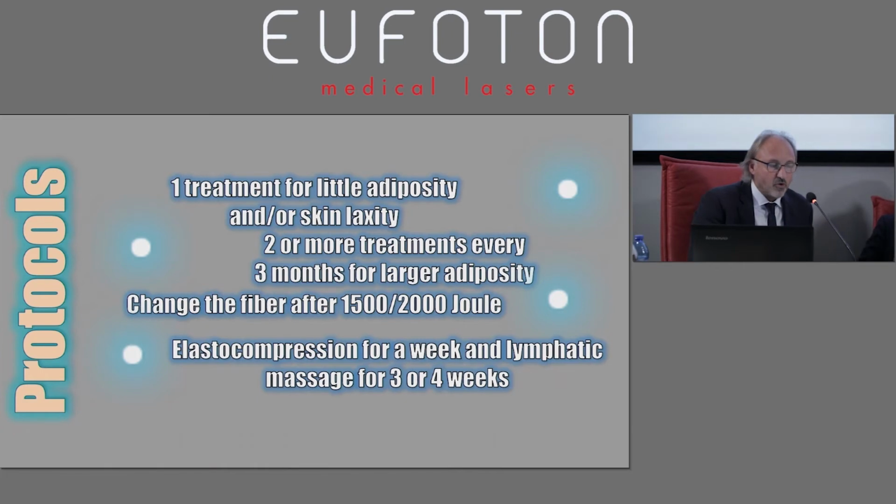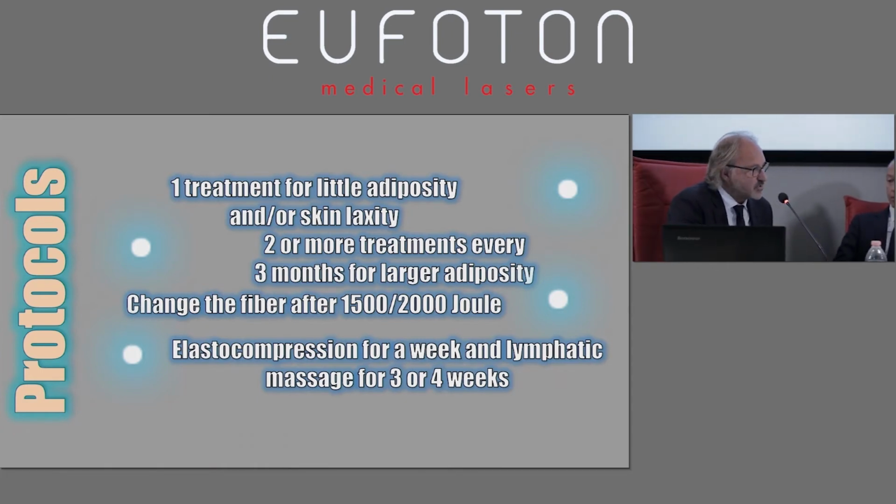So protocols, one session or more than one, with this Endolift approach. The one-shot approach is the best approach. Most pleasing to patients. Sometimes instead, for more complex indications and also to reduce the session workload, we can also plan multi-sessions. So 3 sessions will take one entire season at intervals of 3 months.